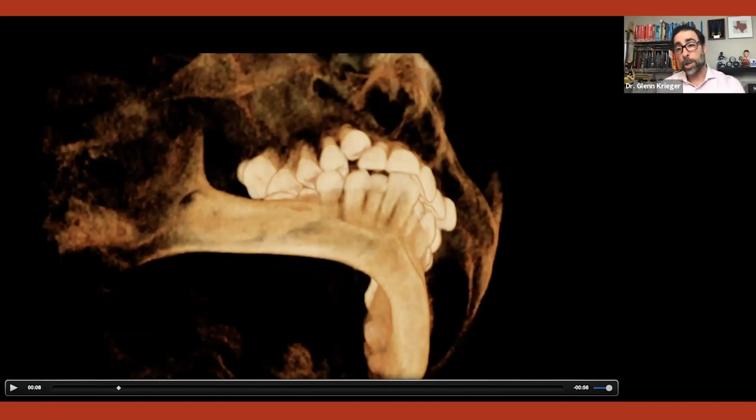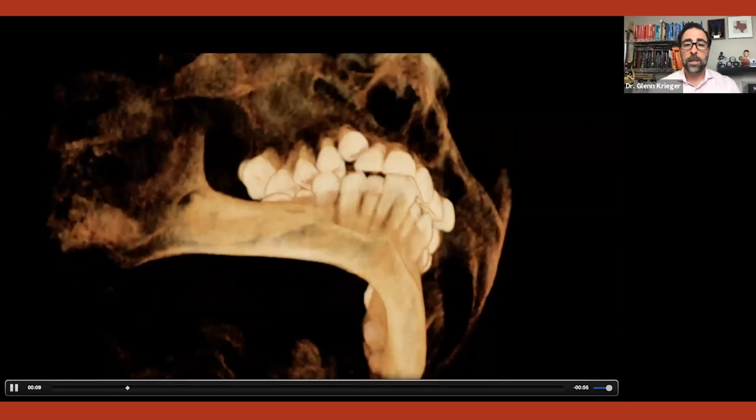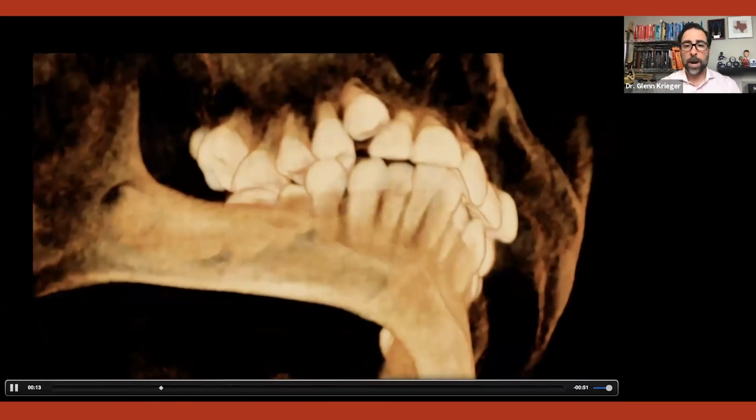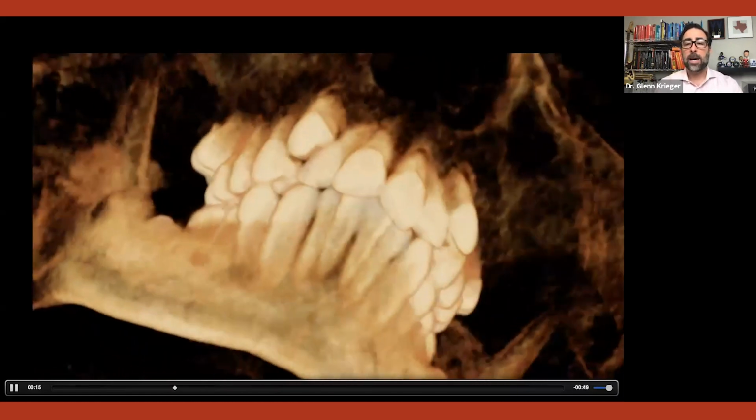Where am I going to get that exact space? If I can measure that, which I can using my CBCT, I can measure the space I've got and the width of that cuspid. Now for my equation, I know exactly how much room I have. But I don't get this with a pan. I don't get this with a ceph. And this is my bread and butter case. This is what walks through my office on a regular basis every day into my practice.